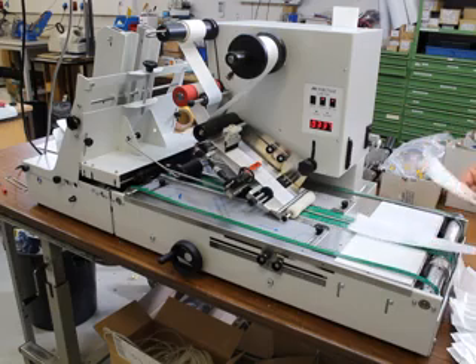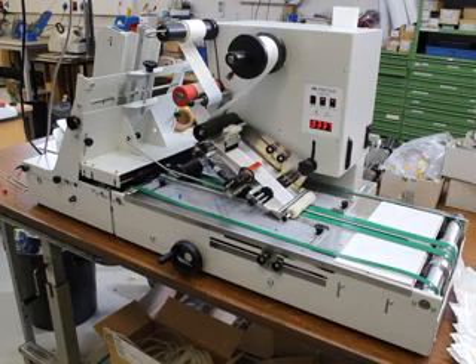Also with this roll, it applies additional pressure, so it makes sure the label is fixated strong.